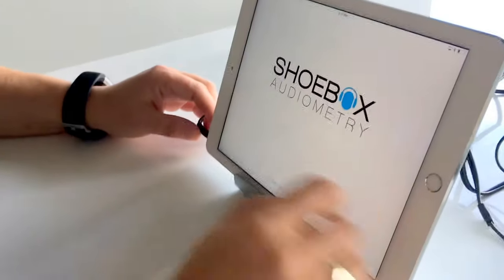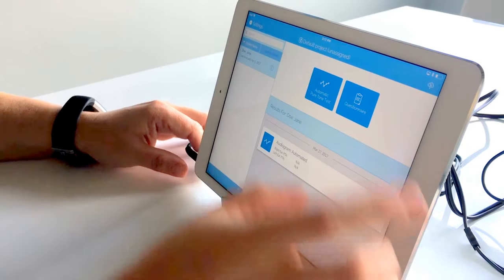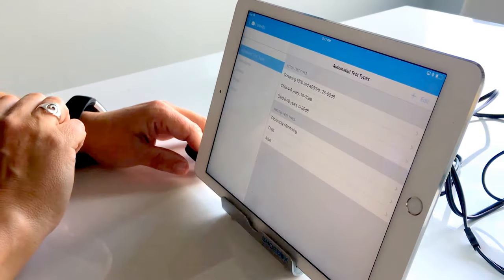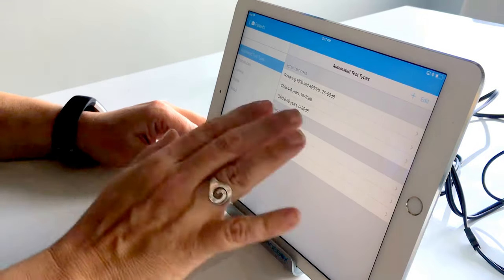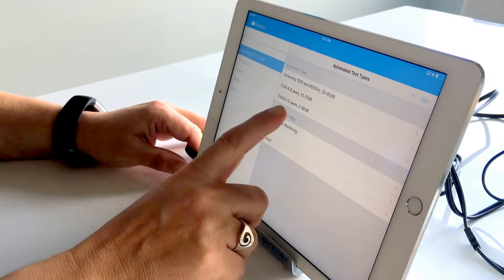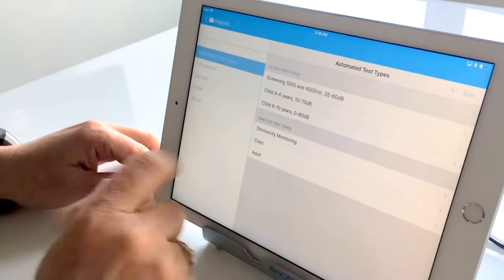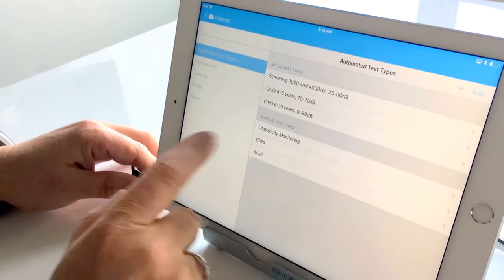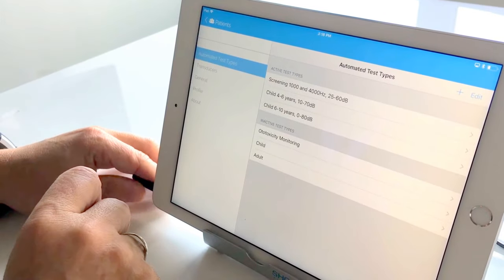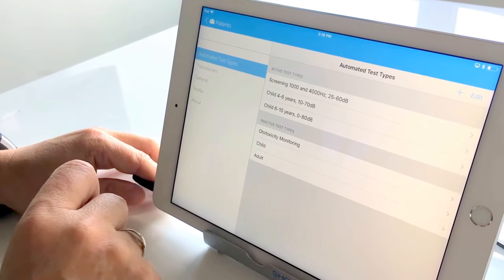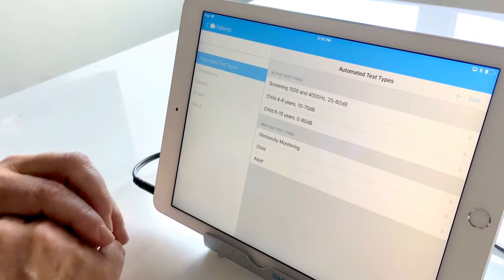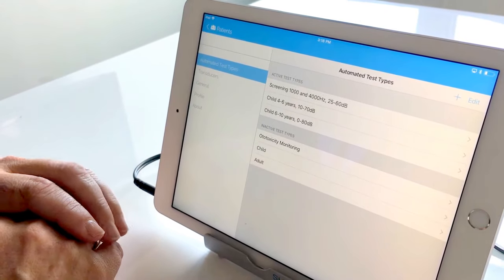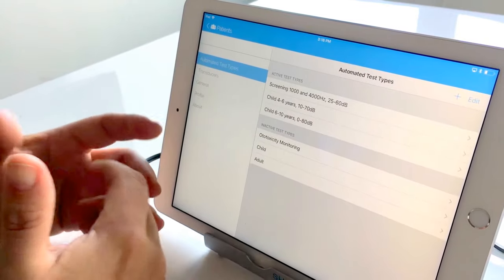We'll go ahead and open up that platform and you need to go into your settings tab in your automated test types and you'll see here that you have a selection of active test types and inactive test types. I've actually gone ahead and pre-configured some of them, but let's go ahead and configure a brand new one.